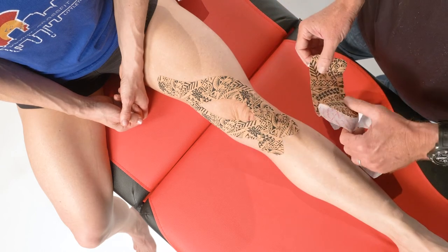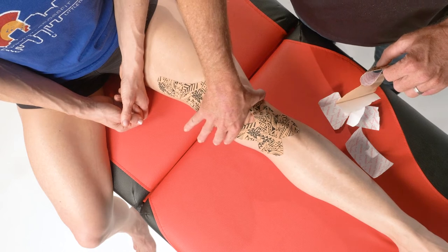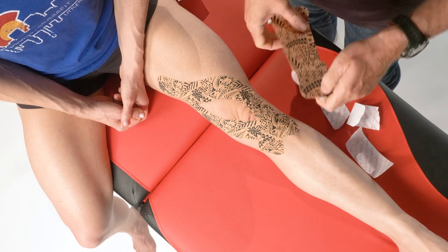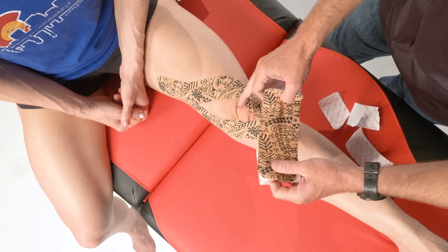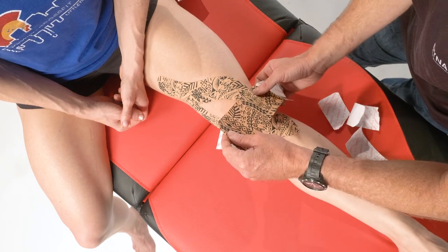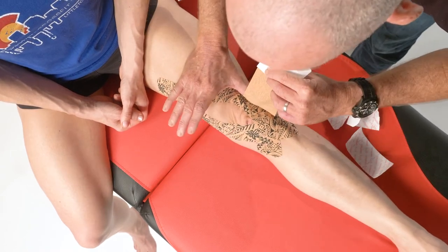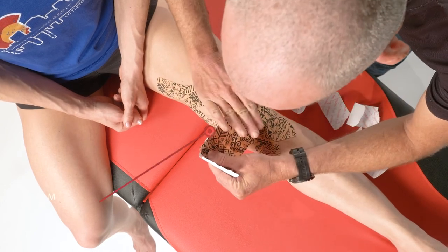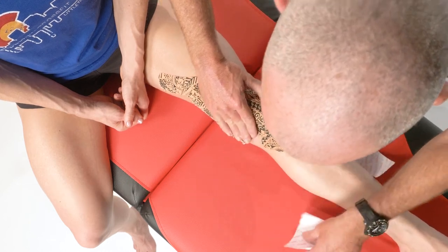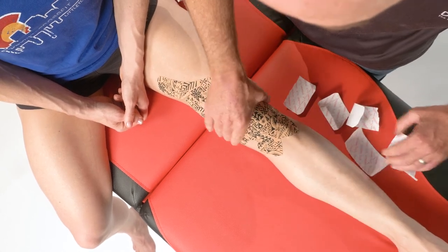If you want to lock over the top of everything and get a little more medially directed force and force closure — to help stabilize and maintain the patella within the femoral groove — we can come over the top using the three inch tape. Line that up with the top of the patella, start once again on the skin laterally to get good adhesion, apply that medially directed force with a little tension, sweep through, and make sure there's absolutely no tension on this medial aspect of the knee, as it breaks down fairly easily if the tape is shearing on the skin there.